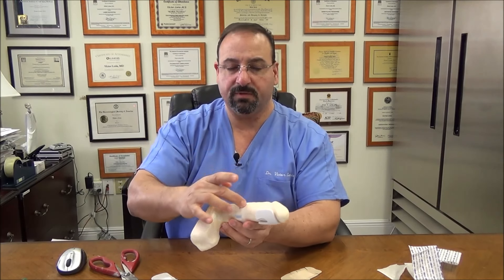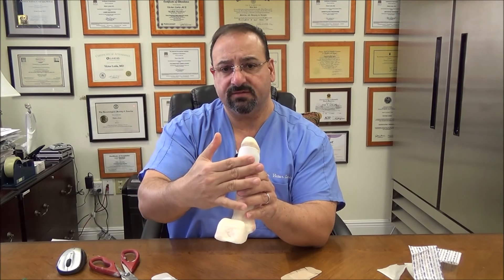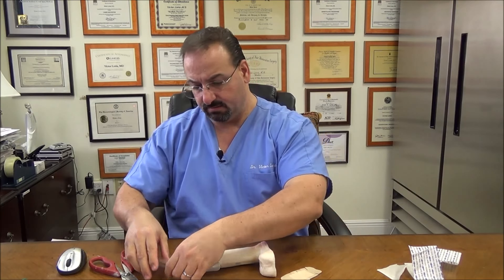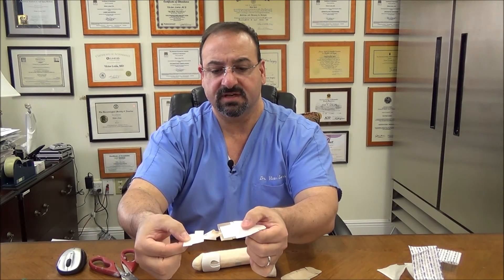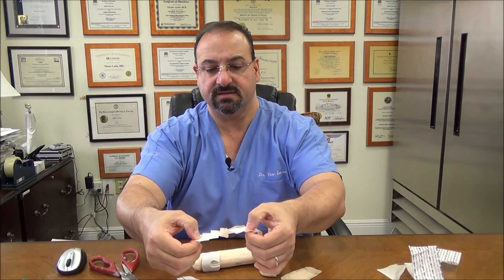So what did we do so far? We glued down our band-aid, put our toe pads underneath the glans, and now we're going to put our band-aids on. Carefully take these off — it's a little different because they're cut. See how it's coming off like that? Pull them off nice and easy so it doesn't tear.